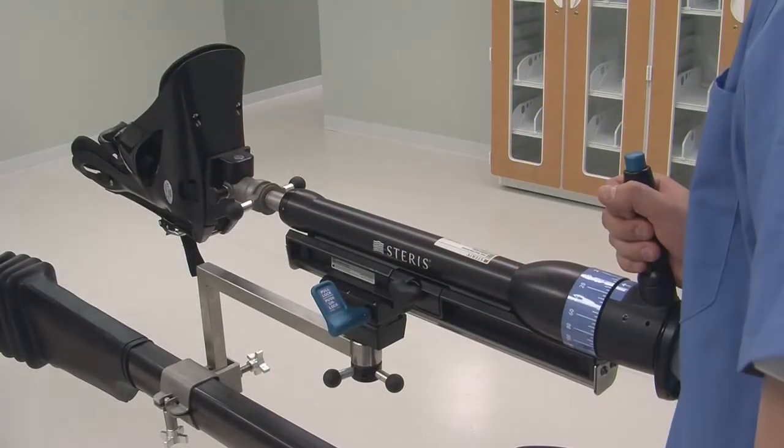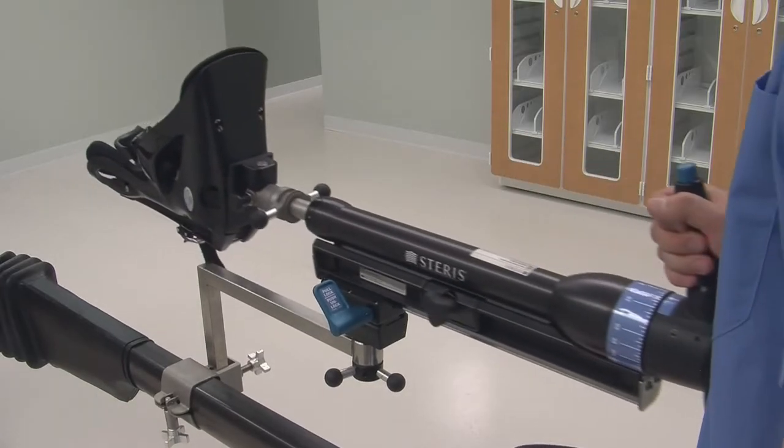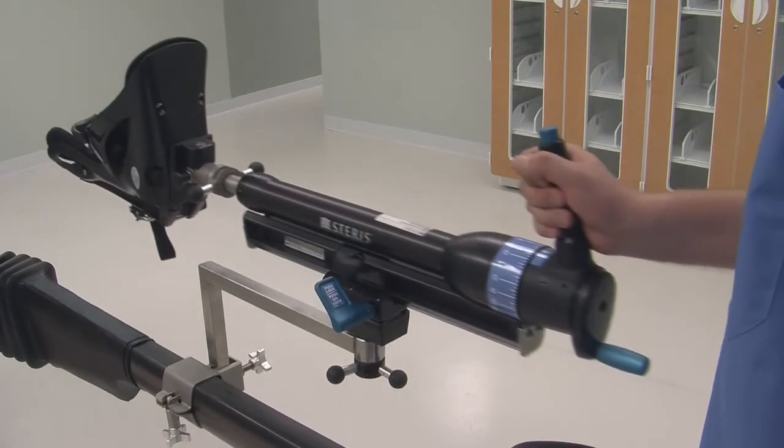Following these steps, we'll provide the assembly required to achieve proper setup for patient traction on the OT1000 series tables.